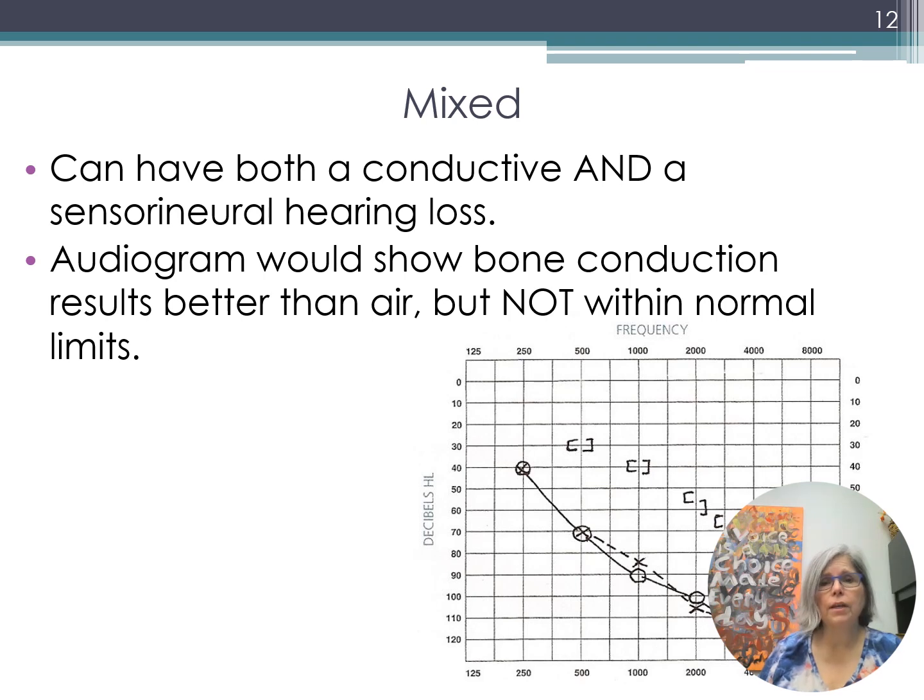And this audiogram indicates a mixed loss. The bone conduction symbols on here are elevated, but better than air conduction thresholds. In the PowerPoint slides I have to go along with this, I have a little bit more information about the symbols related to audiograms. Refer back to that if you need more refresher on the symbols themselves.